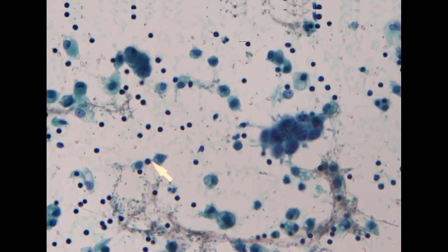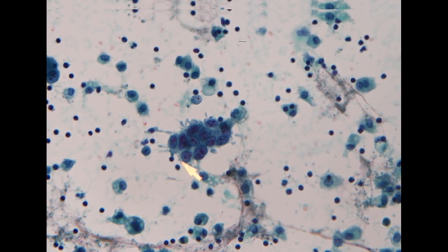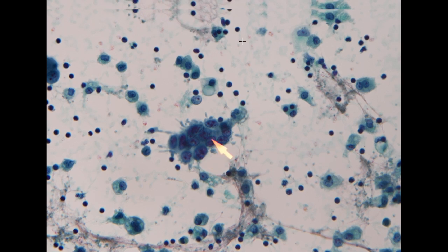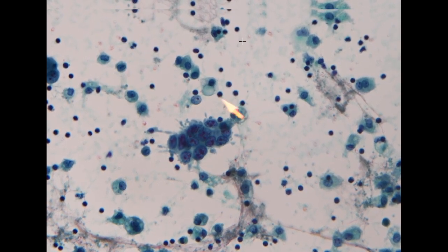And here, this cluster demonstrates highly irregular nuclear contour along with a very irregular chromatin pattern and is arranged in a vague glandular pattern. So these look like adenocarcinoma.